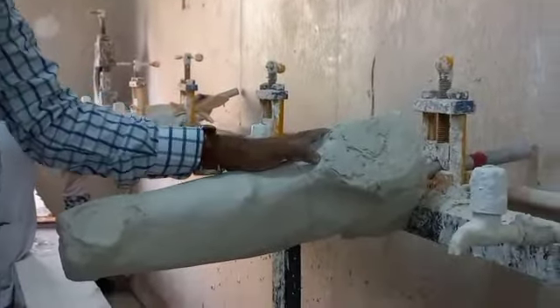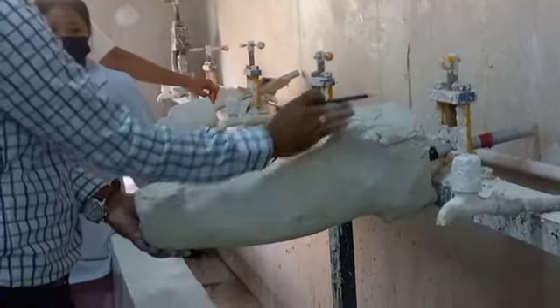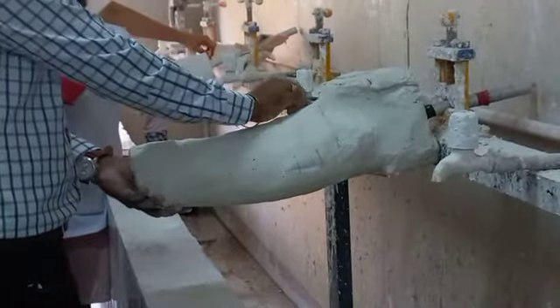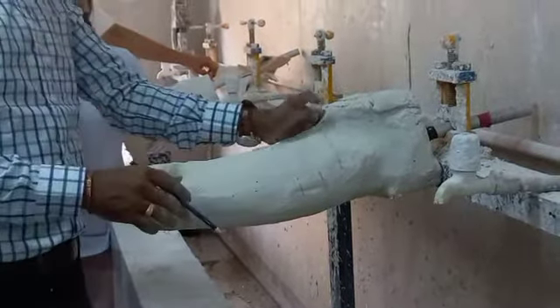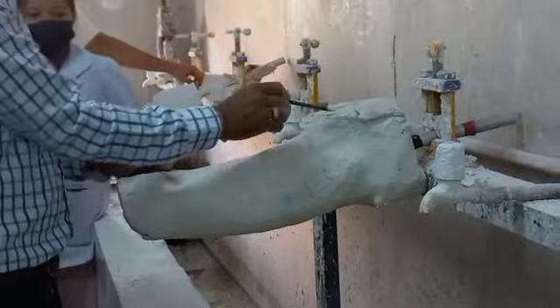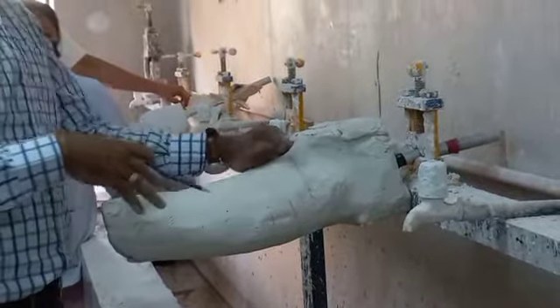On the posterior side we have gone down. Although if we cover it to the same height as the posteromedial, that means the posterior side is covered to the same level of the posteromedial, in that case it will be ischial ramus containment. Otherwise it is just a ramal containment.